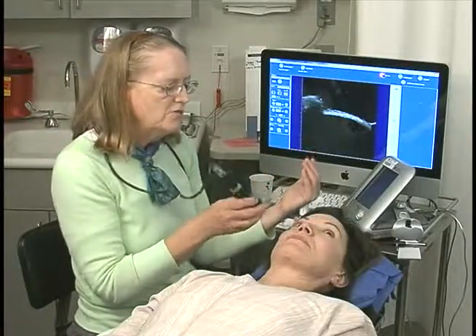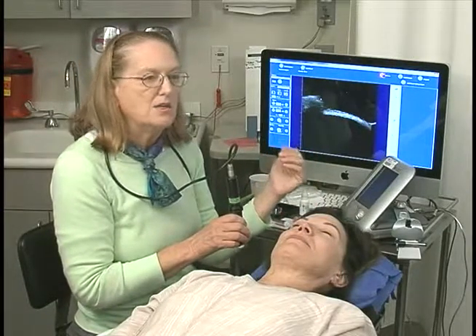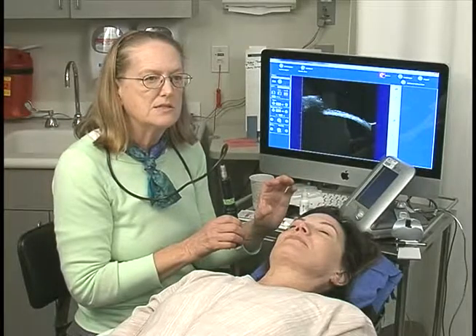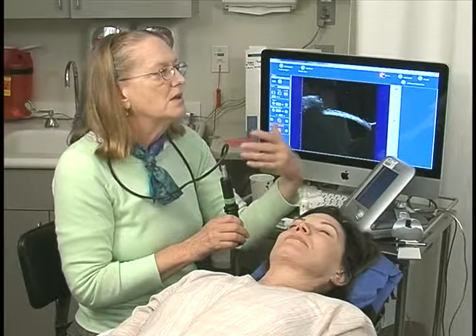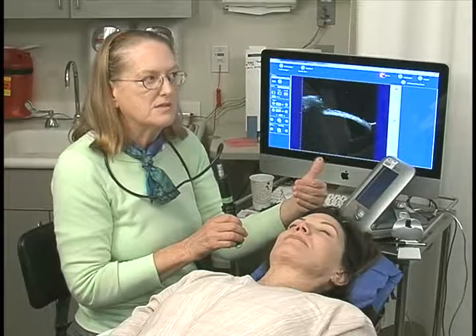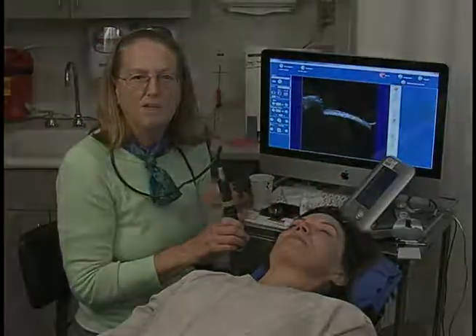And that's very useful for looking at and documenting multiple iris cysts, a ciliary body lesion, ciliary body cysts, foreign bodies, that sort of thing.